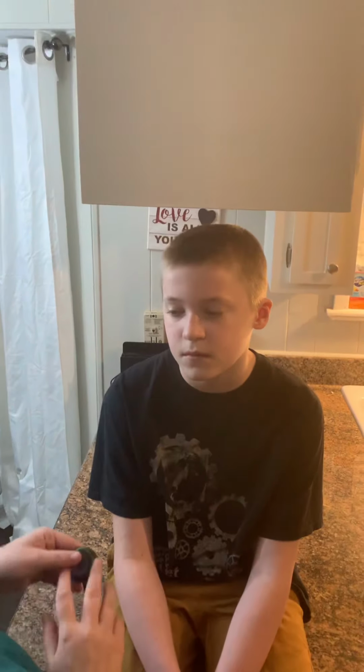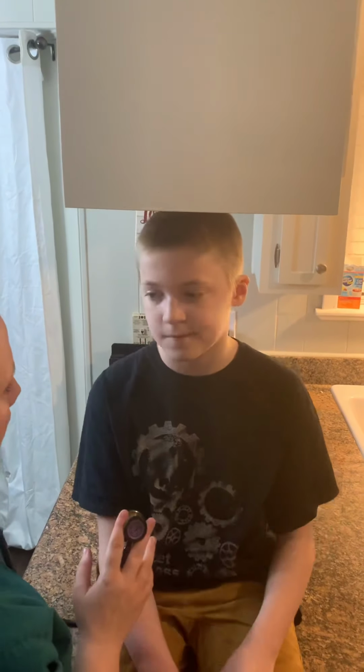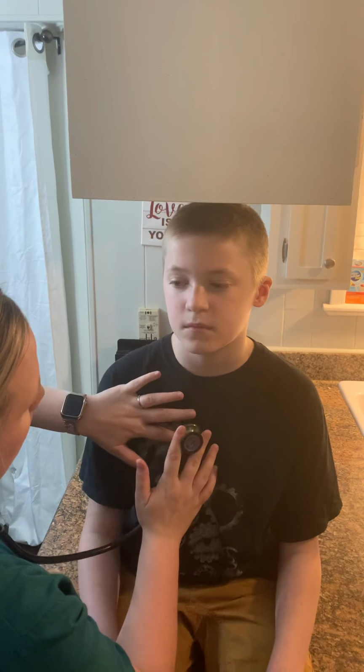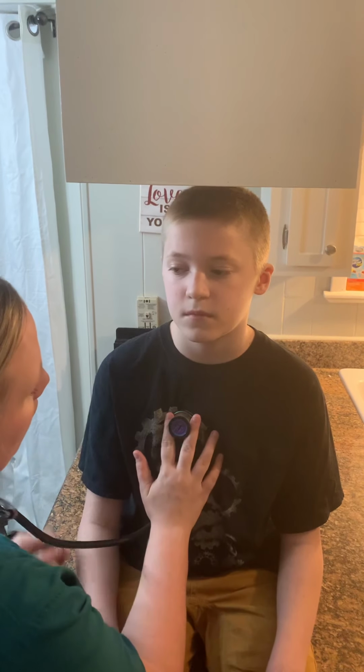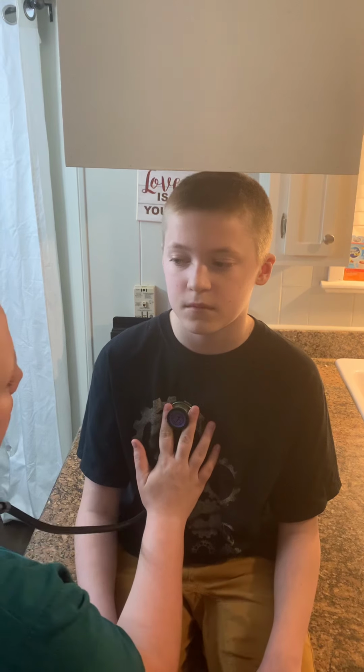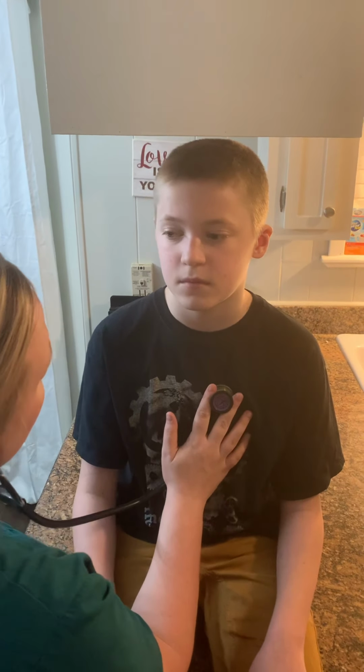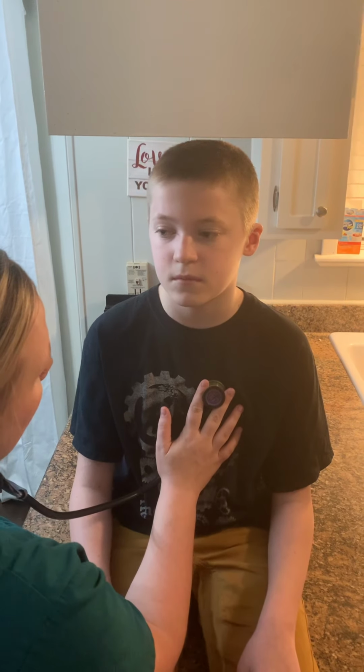So the next thing that we're going to do is I'm going to flip back over to the diaphragm of my stethoscope, which is the larger side, and I'm going to listen to several different parts of your heart, and I'm going to call out the names to those as I listen to them, okay? All right, on the diaphragm, the first thing we're going to do is go to the second intercostal space, which is right here, on the right sternal border, and we're going to listen to your aortic. And then we're going to go to the left sternal border, second intercostal space, and listen to your pulmonic.